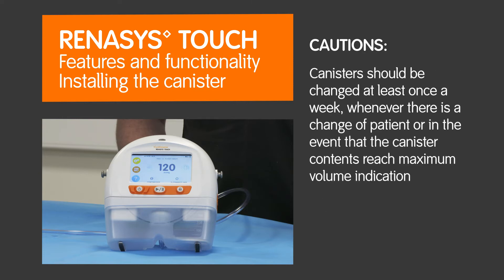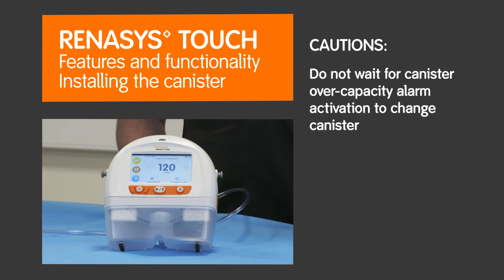Canisters should be changed at least once a week, whenever there is a change of patient, or in the event that the canister contents reach maximum volume indication. Do not wait for canister overcapacity alarm activation to change the canister.